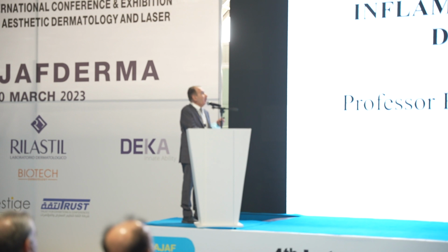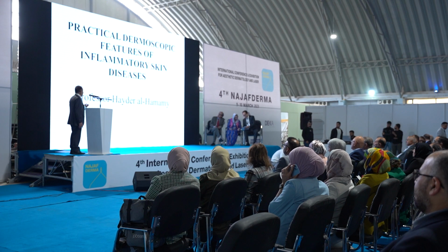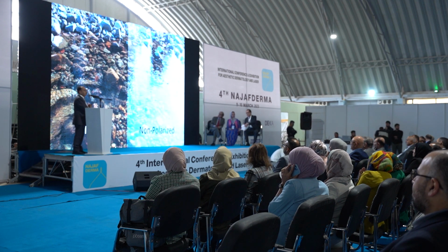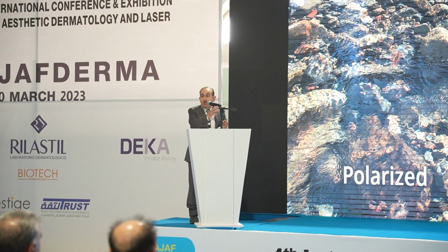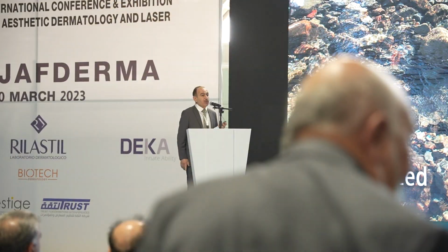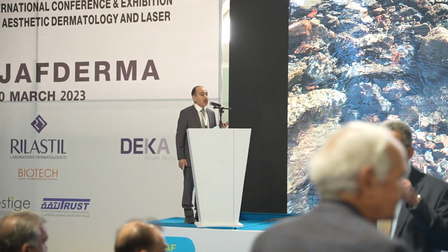I want to talk to you about some practical dermoscopic features of certain inflammatory skin diseases. And as you know, dermoscopy has been widely used in recent years to help us in the diagnosis of many skin diseases. For those people who don't appreciate the importance of dermoscopy, I'm going to show you two pictures.